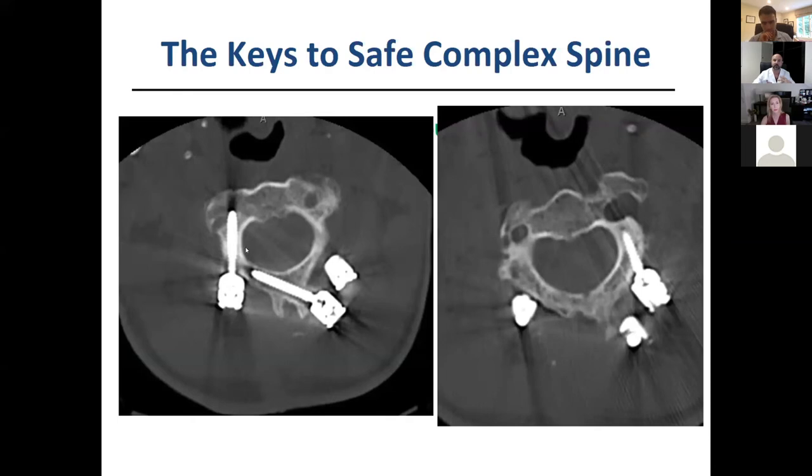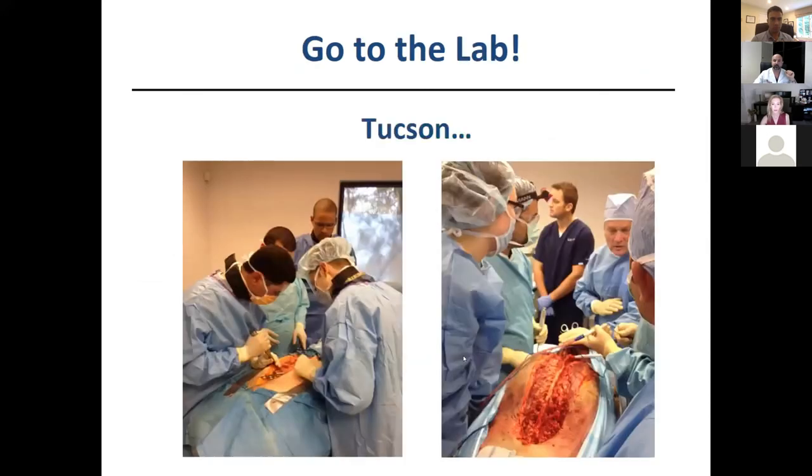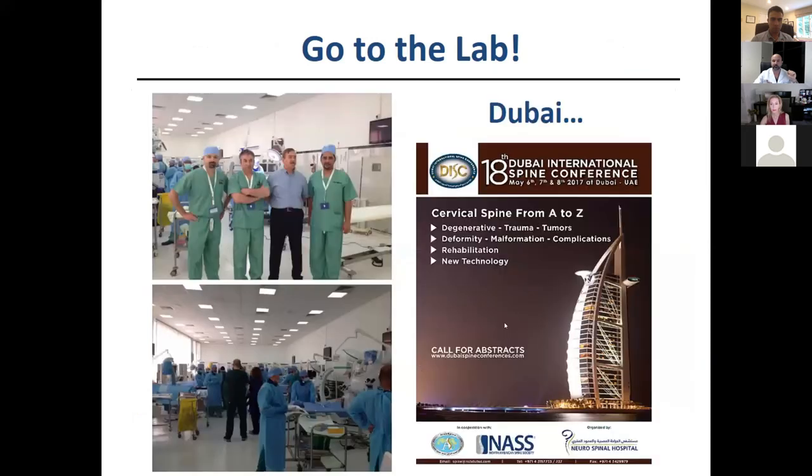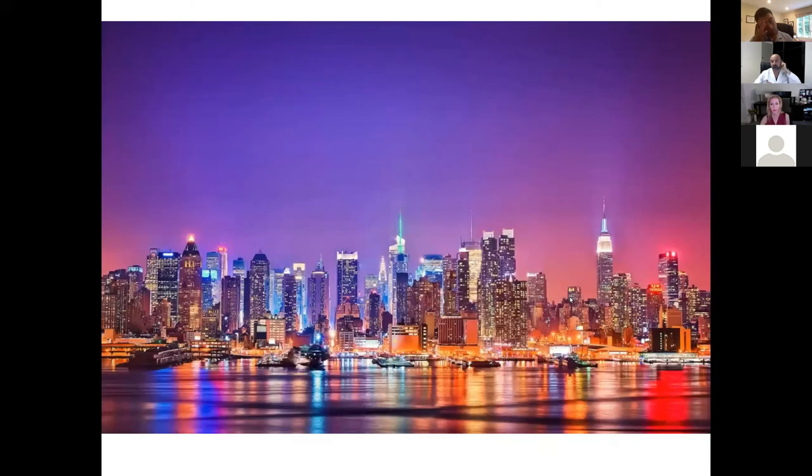So in this patient, we did one pedicle screw, one translaminar screw, and one PAR screw in the same patient. This was C2. If you just know how to do a pedicle screw and the patient doesn't have a pedicle at C2, you're not going to be able to fixate there. It's always good to have, with or without navigation, multiple skill sets you can employ for each patient. And of course, like I said, I love the lab, and I really encourage people to look at the anatomy very closely. And I'm going to end it here.